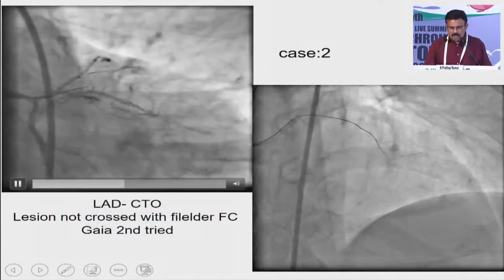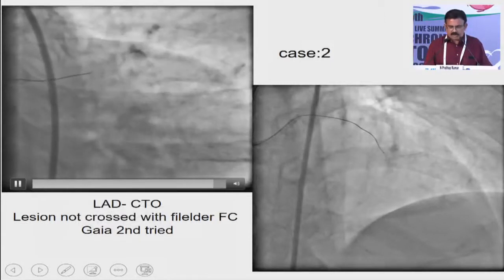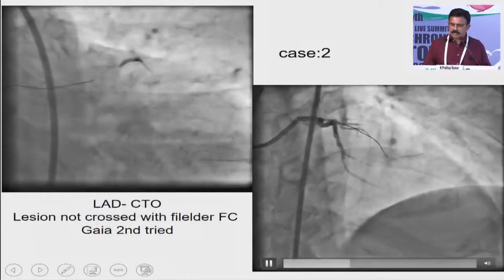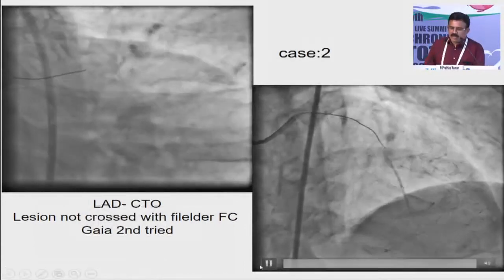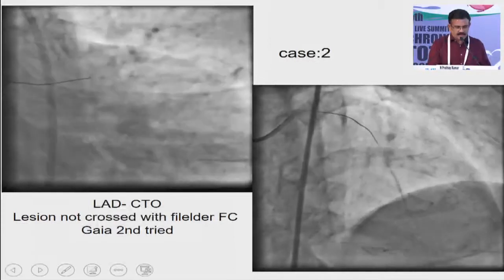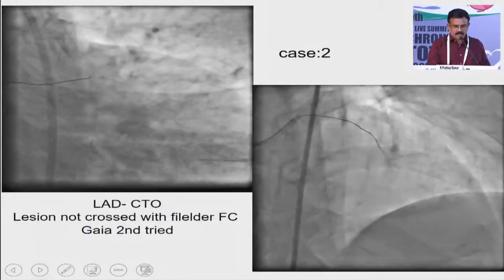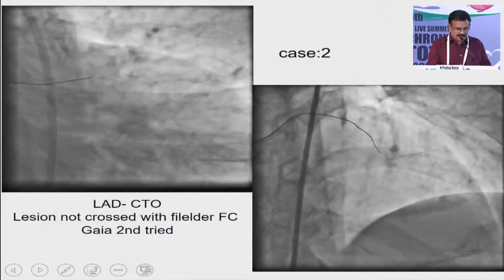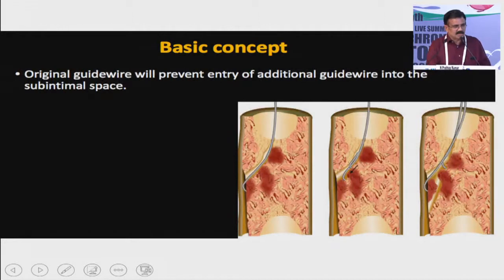This is a CTO of the LAD, lesion not crossed with a Fielder FC, and Gaia Second again tried. You can see the wire is totally out of the track. Once the wire is totally out of the track, it's a real complex situation in this slide changing, so you should give me some time.